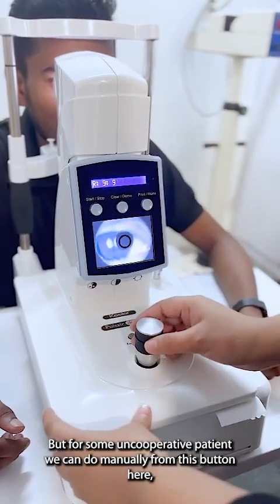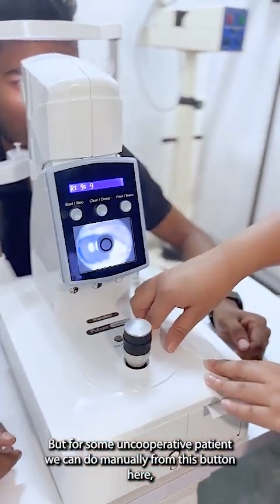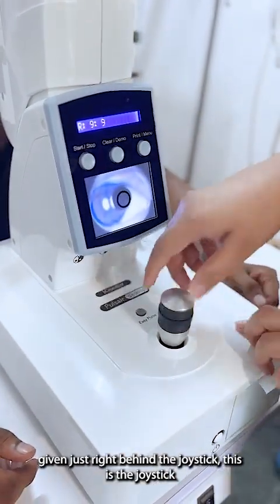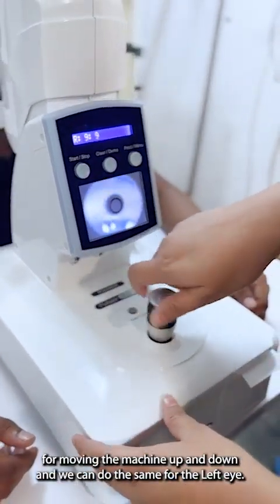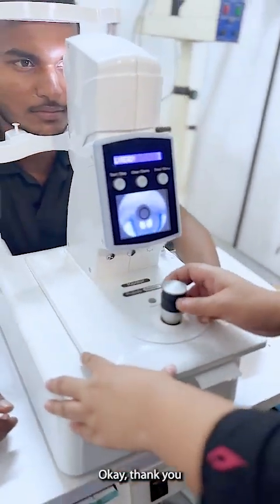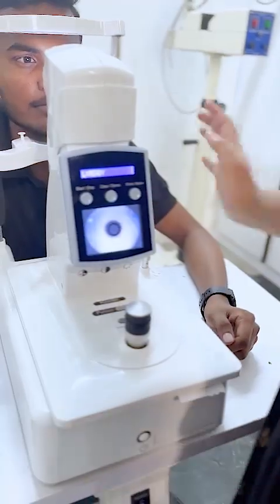For an uncooperative patient, we do it manually using this button, located just right behind the joystick. This joystick is used for moving the machine up and down. We can do the same for the left eye. Okay, that's it — thank you.